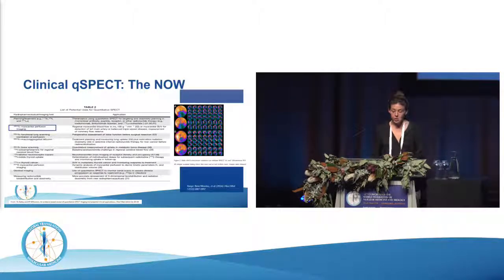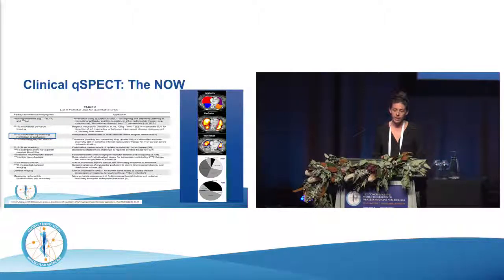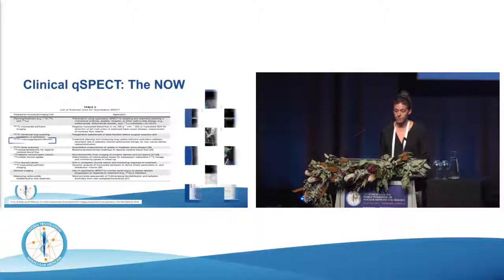Myocardial perfusion imaging, quantitative SPECT, obviously very desirable there. The GE system lends itself very readily to that with the additional sensitivity and speed of acquisition, if you like, on the semiconductor detectors. The idea of fully quantitative technetium lung scanning for ventilation perfusion, this is something that we've been interested in for a long time at the clinic at Royal North Shore Hospital. We've done a fair bit of work on quantifying the lobar function for both ventilation and perfusion and using this to estimate loss in lung function for patients that are having surgery to remove lung cancer.